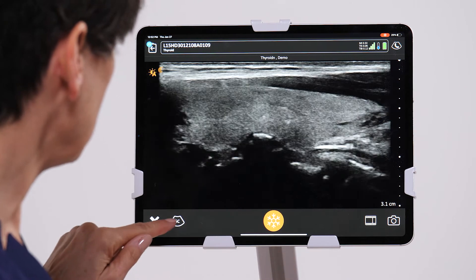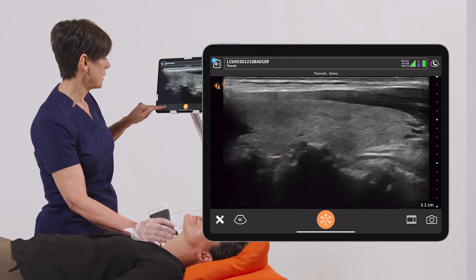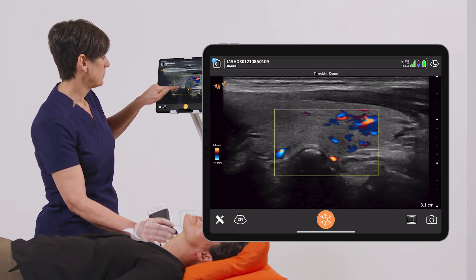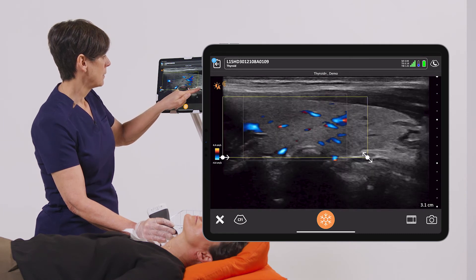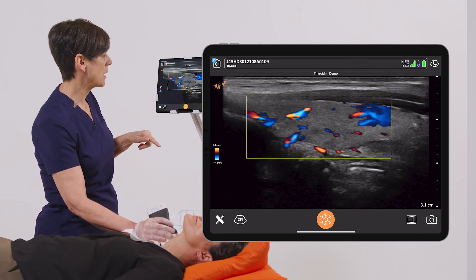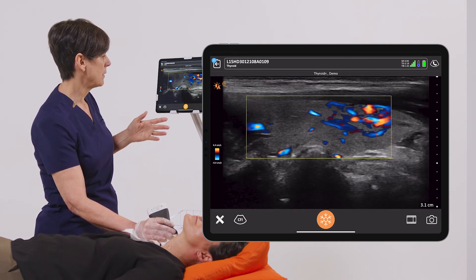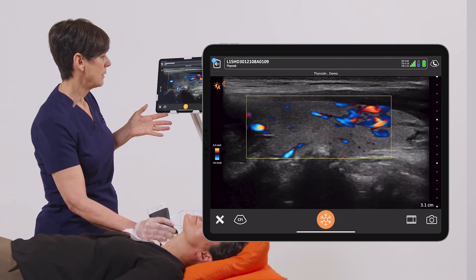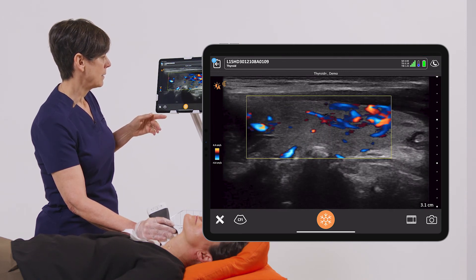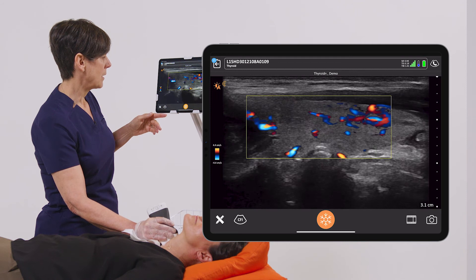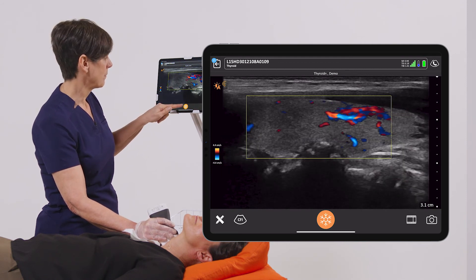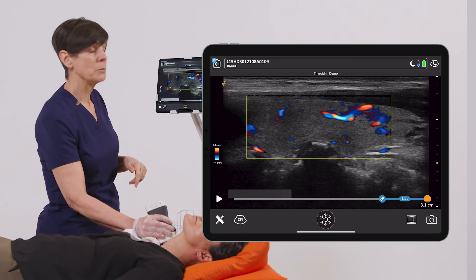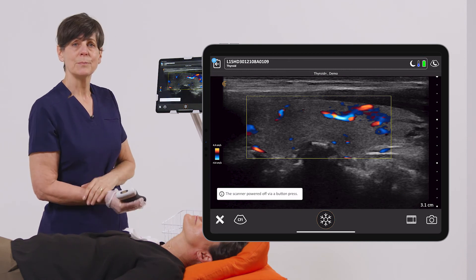The last thing I'm going to do is see what the blood flow is like in the thyroid. By turning on the color Doppler, I can place the color box over the thyroid just to make sure that there is blood flow there and that I'm not seeing any masses. We can take that image as well, and then we'll do the same on the left side.